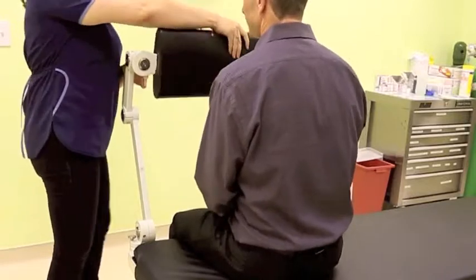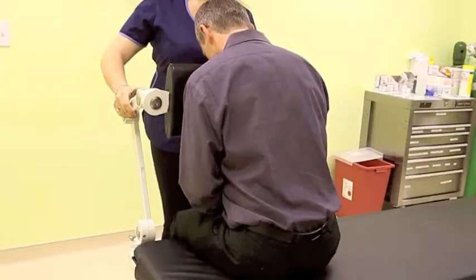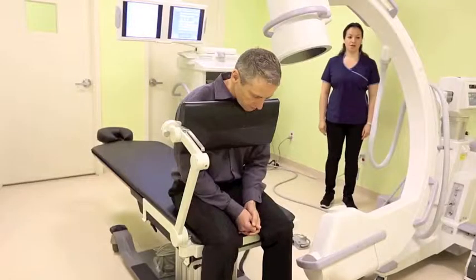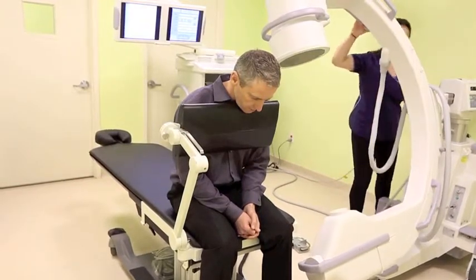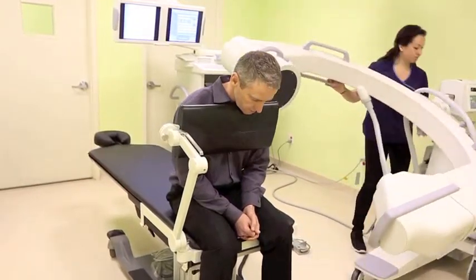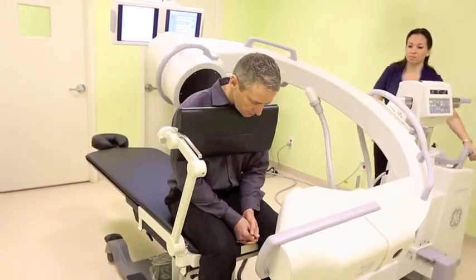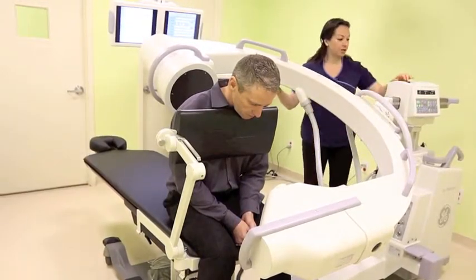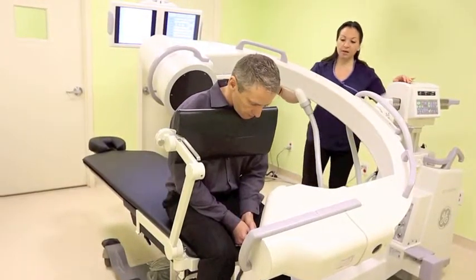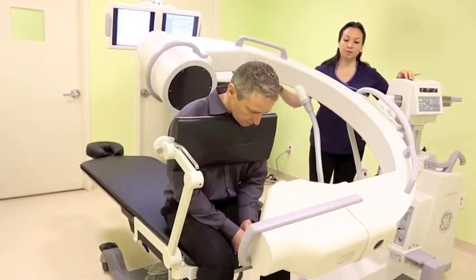Put this around and adjust it. From the regular position of the C-Arm, you go first to the A-P position, put it around the patient, and then you can adjust the level where you want to inject — either putting the table up or down, or the C-Arm up and down.